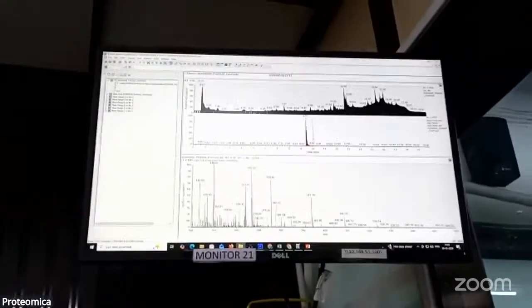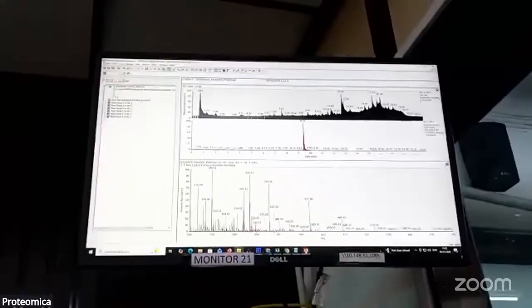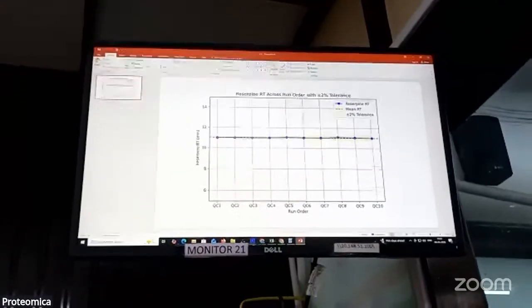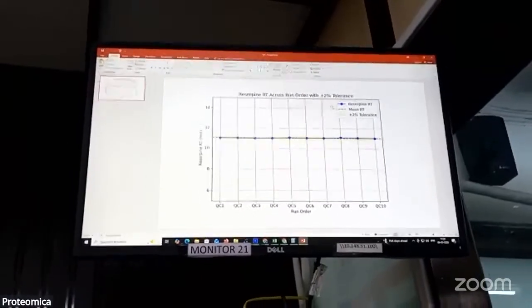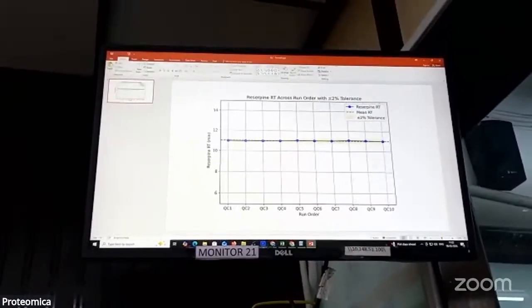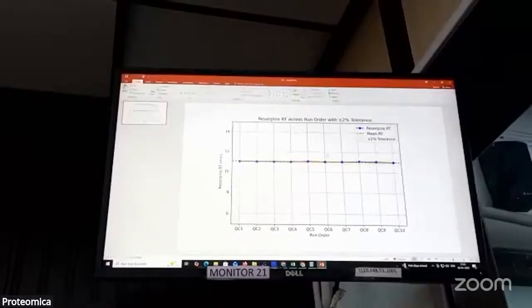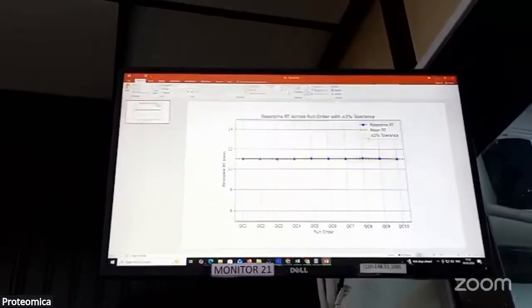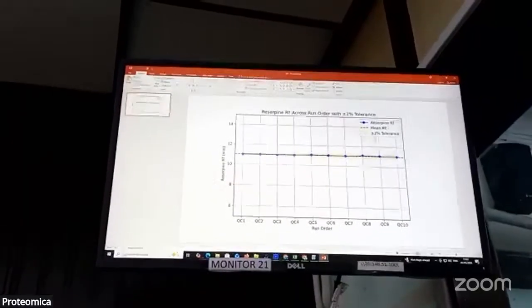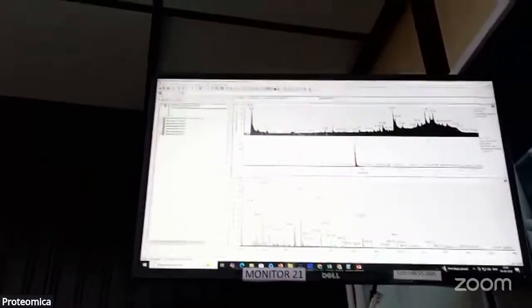Metabolomics can have a lot of variation. That's why we use a reserpine standard, which is a non-endogenous component that is not found in any kind of sample. We spike in the reserpine and check whether its retention time is consistent or not. This is the time series plot. The tolerance is within plus or minus 2%. So this is the QC of the global metabolomics.